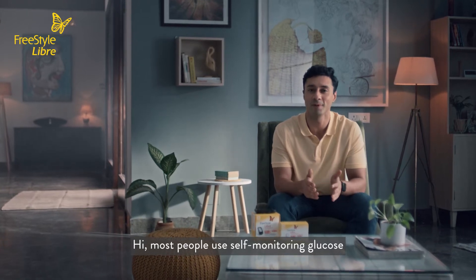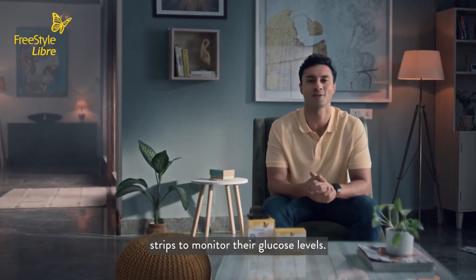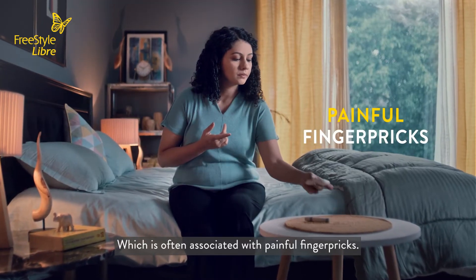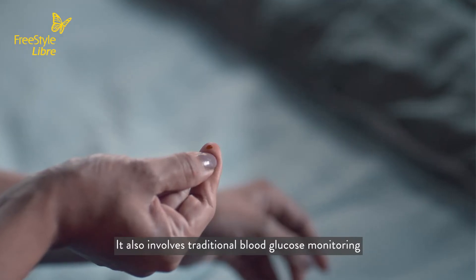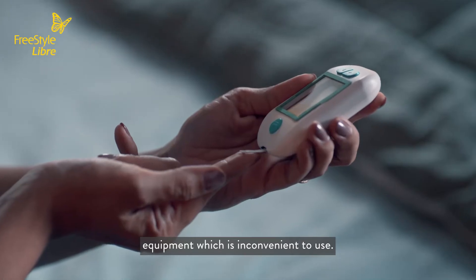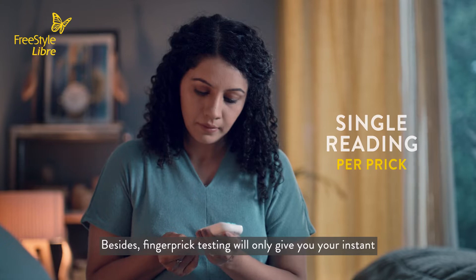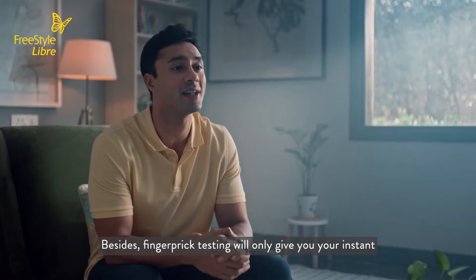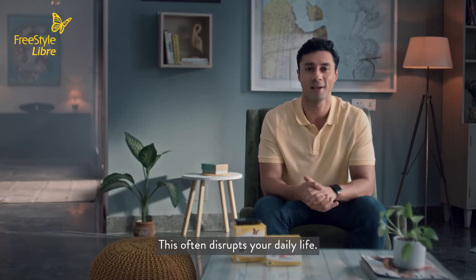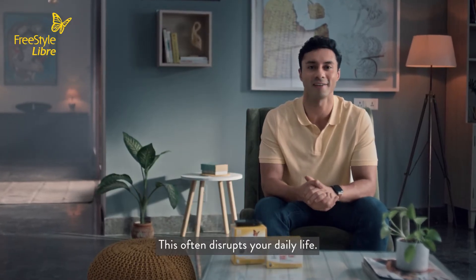Most people use self-monitoring glucose strips to monitor their glucose levels, which is often associated with painful finger pricks. It also involves traditional blood glucose monitoring equipment, which is inconvenient to use. Besides, finger prick testing will only give you your instant blood glucose levels and not the whole story. This often disrupts your daily life.